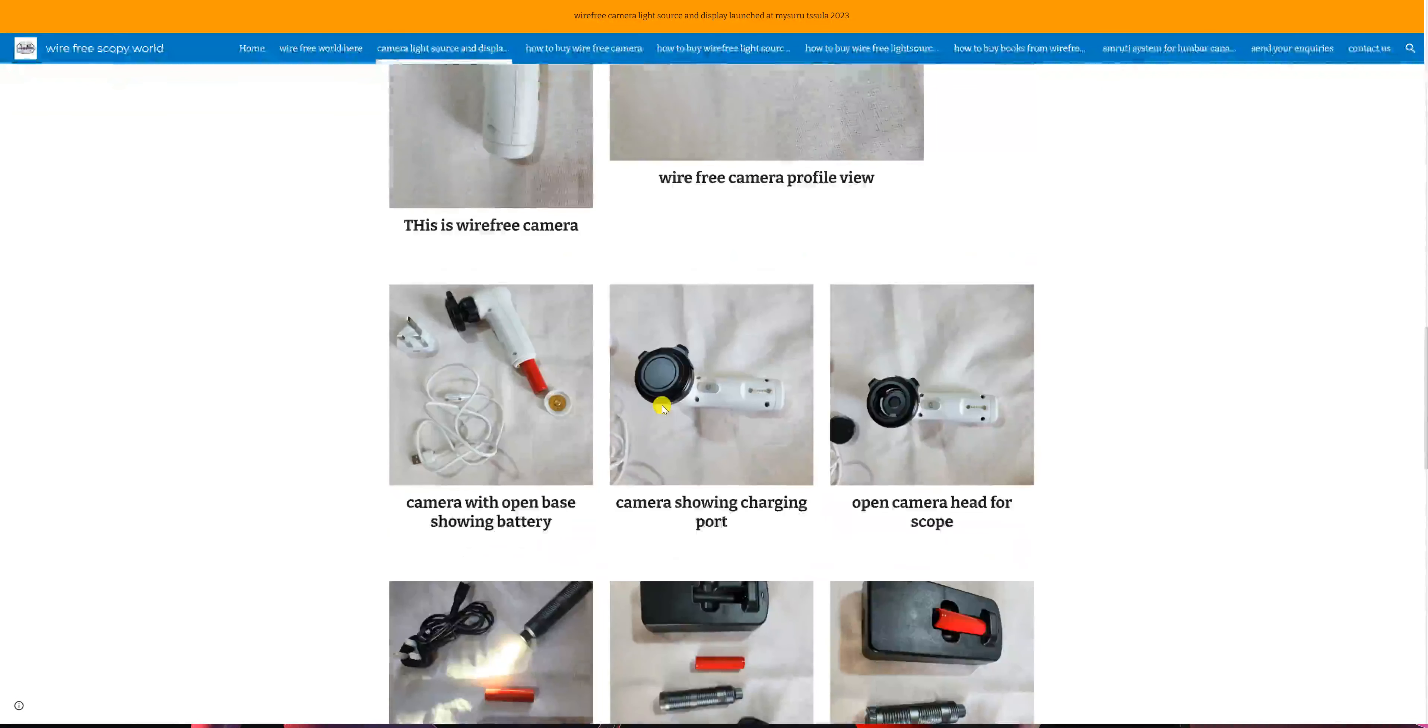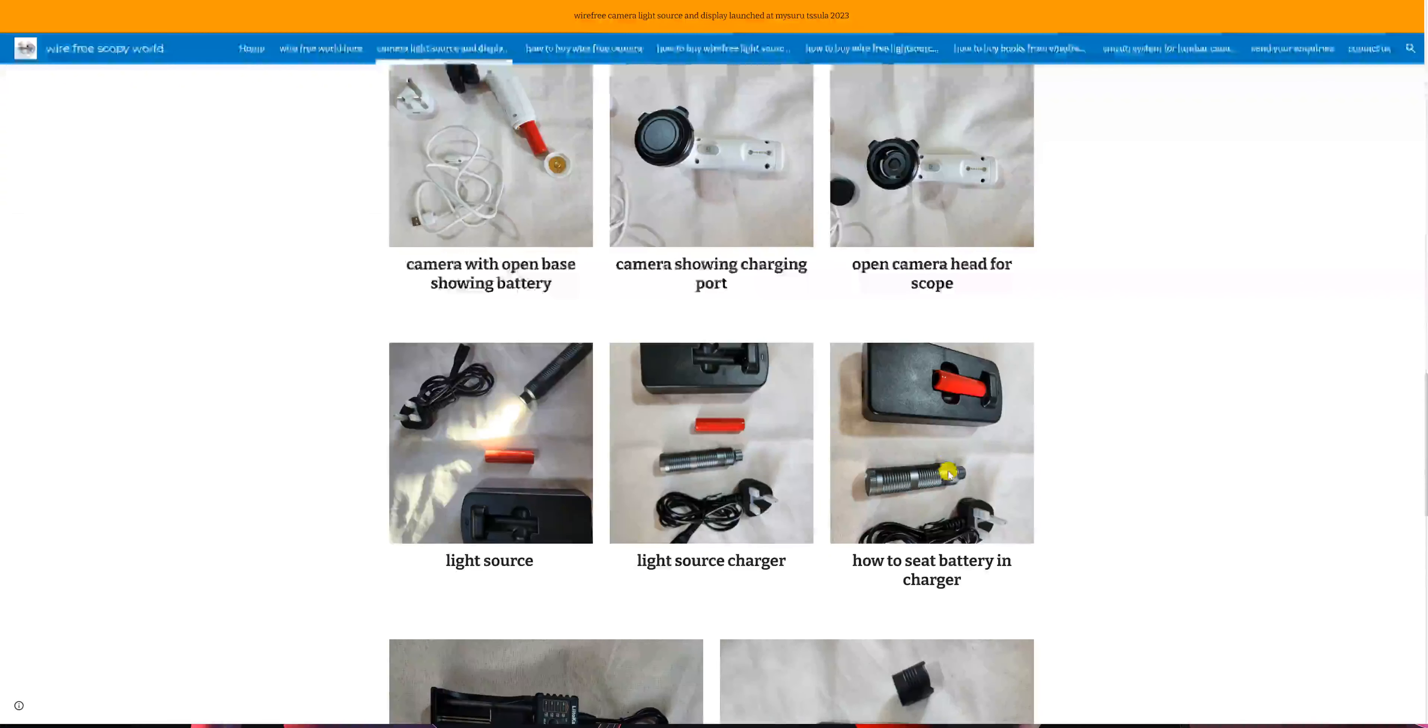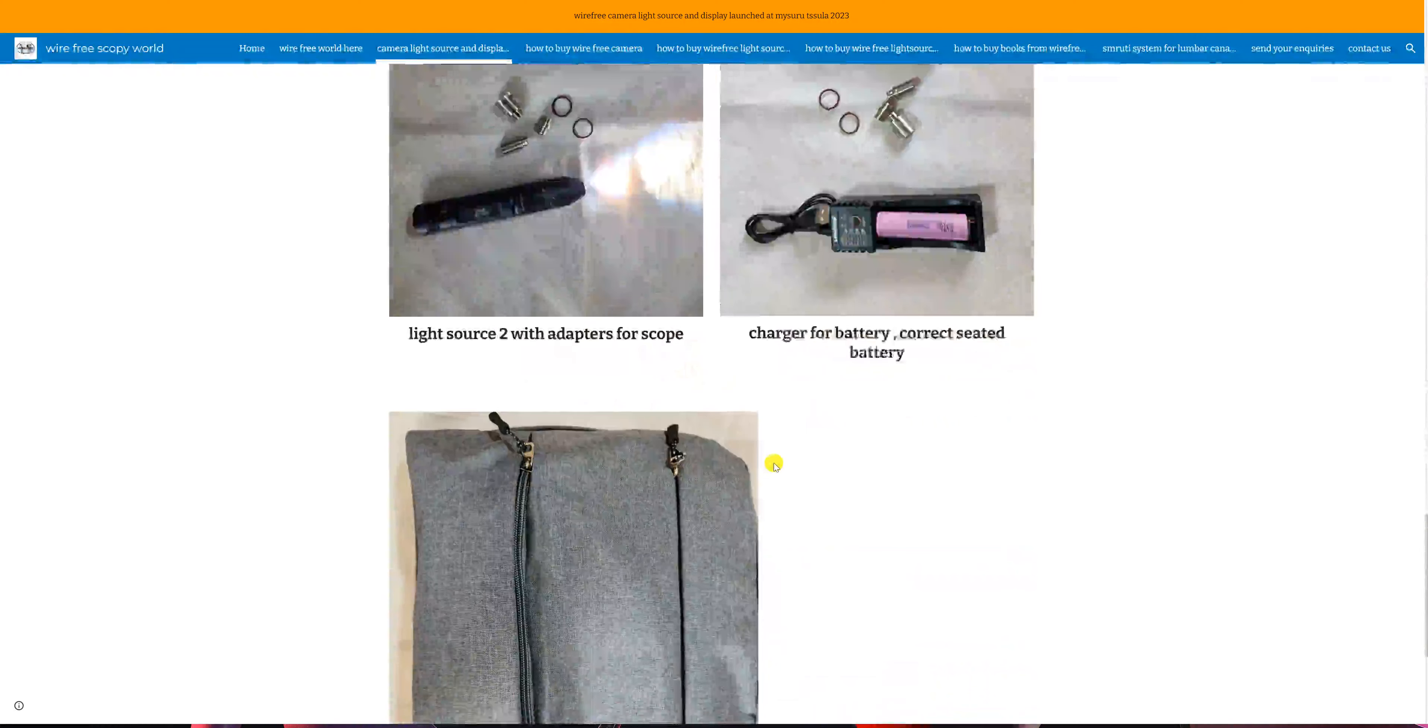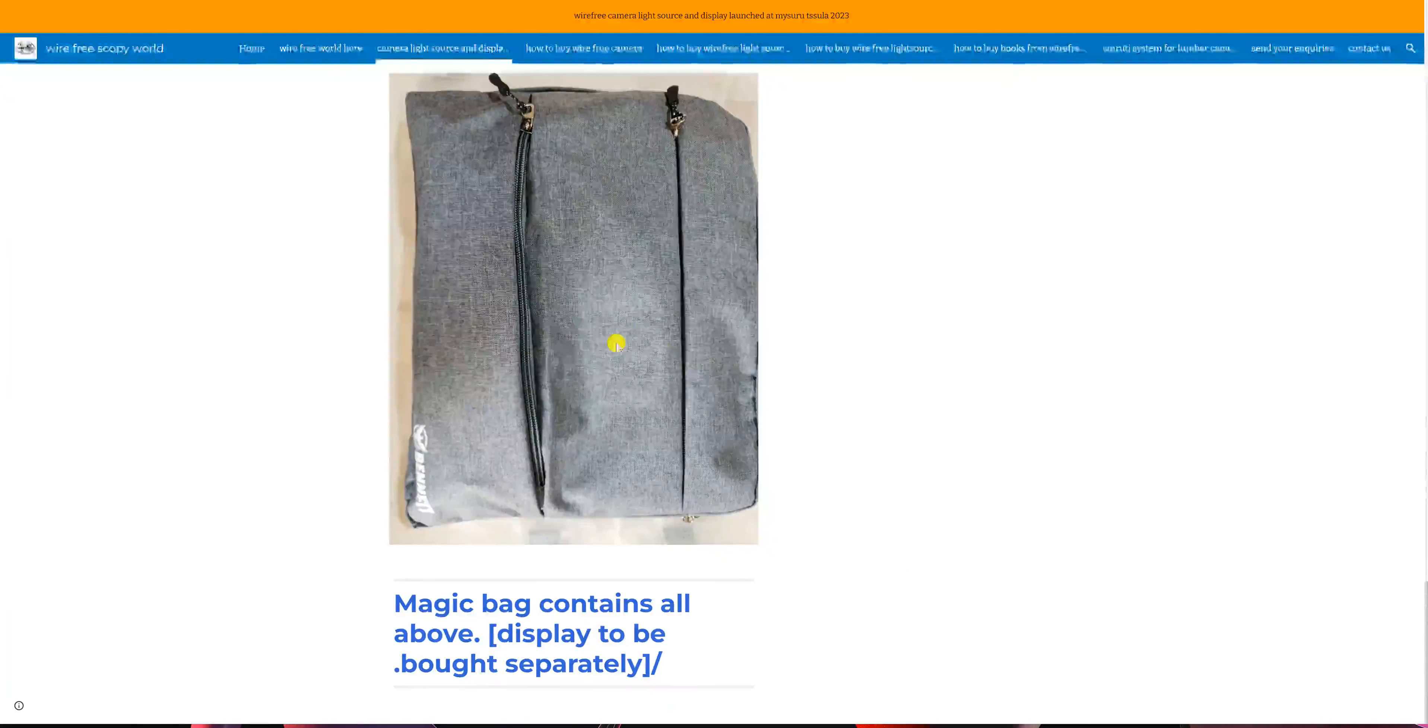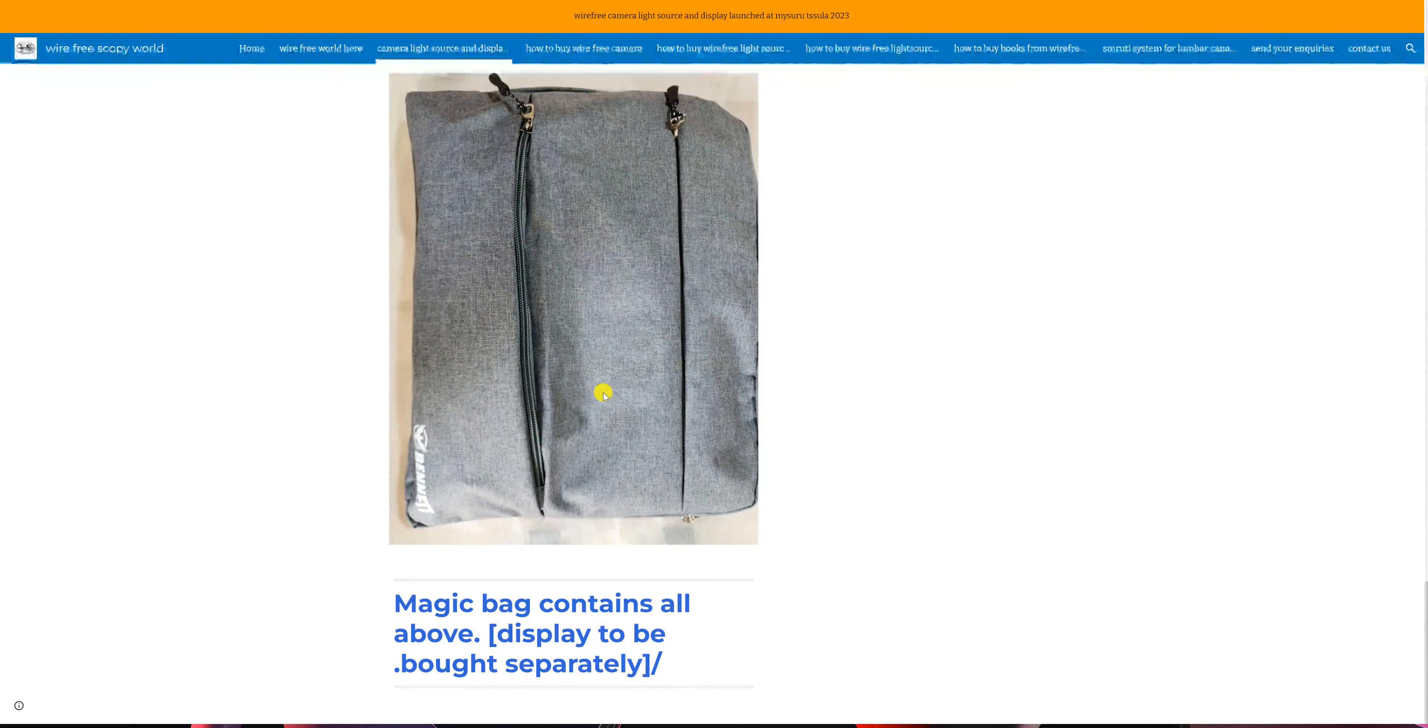In case of type 1 light source, you will find that there is a small knob at this level around the neck of the light source which is the on and off switch. Now this whole thing is contained in this magic bag, and you need to buy the display separately.